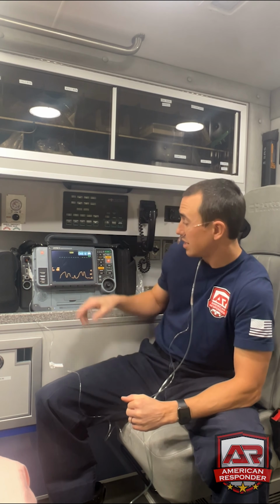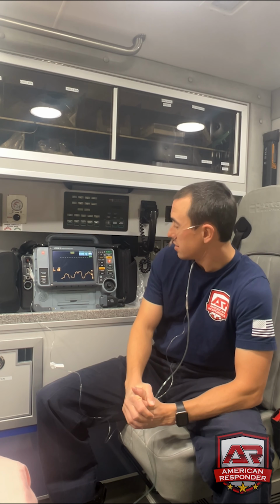If you give a neb treatment and all of a sudden that patient is flashing, or now has fluid in their lungs that you can hear, and it changes from a shark fin pattern to a plateau, we're probably looking at a CHF patient. So we might have to change your algorithms. Of course, CHF is going to be the opposite. We're looking at plateaus. You listen for that fluid in the lungs, high blood pressure, and look for a history of CHF and the important questions. Especially with CHF patients, there are important questions I always ask them.